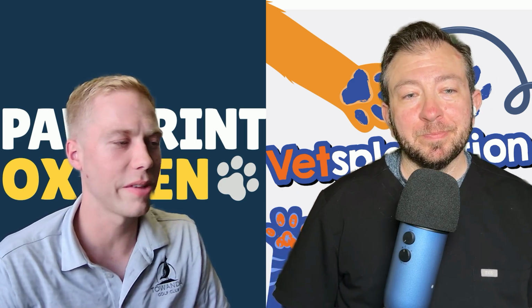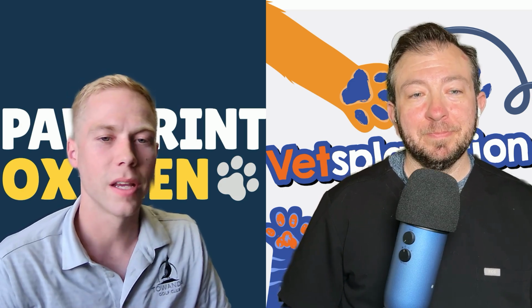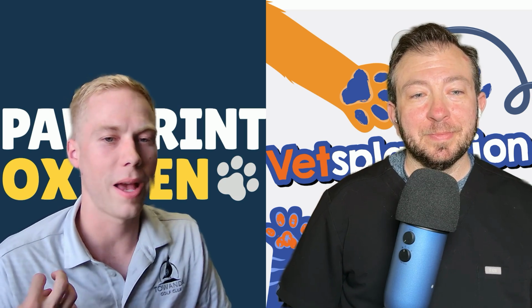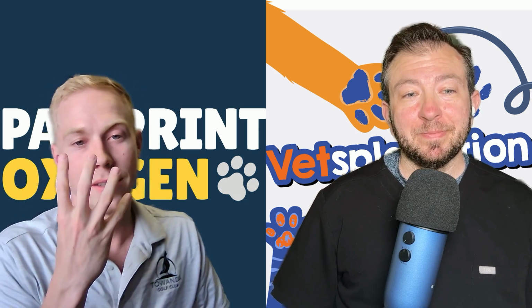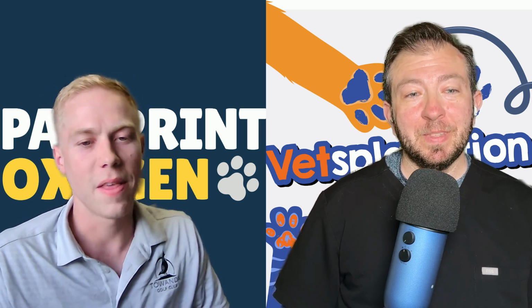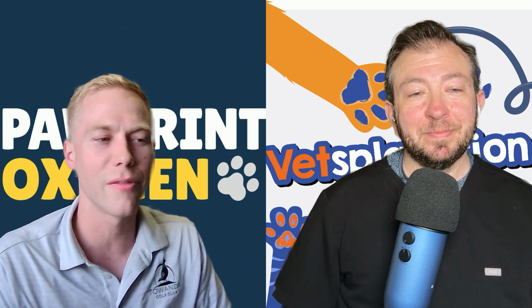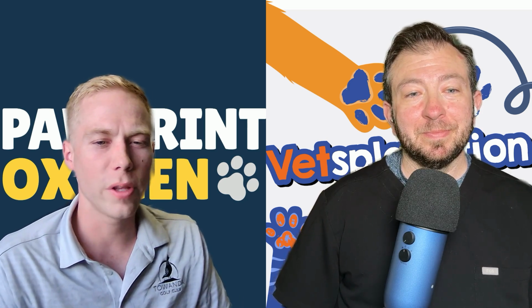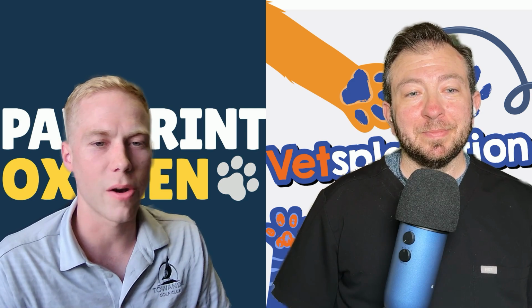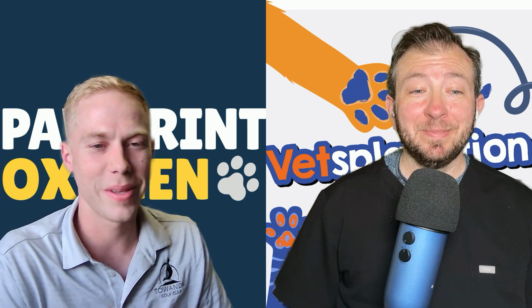Yeah, that's a great point. We have a lot of tips on treat training and things like that. Sometimes it's as simple as, especially for dogs, pulling the mask out when you get it and putting it near your face, like this is safe for me, so it's safe for you. And then we go into some treat training tips. Of course we occasionally have dogs that are a little more sensitive to things around their face, but we've been amazed with how great the compliance has been with this. We thought it would be the hardest thing.